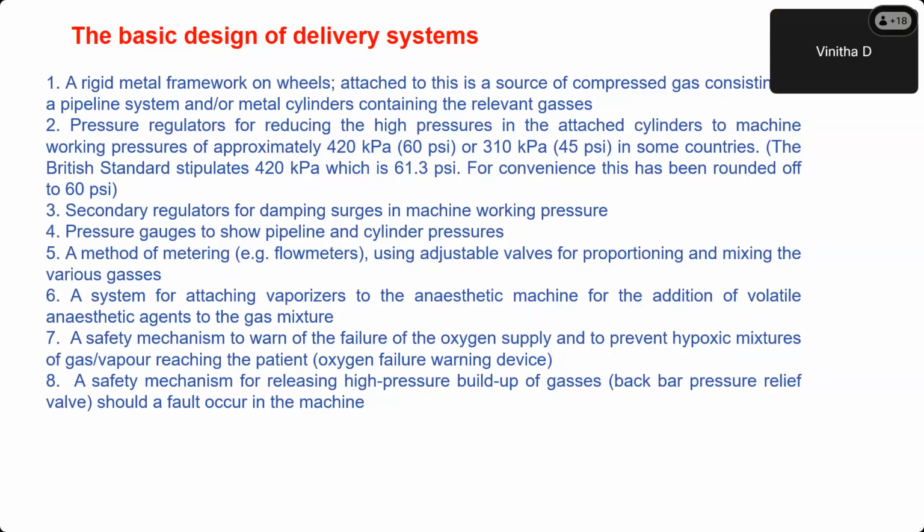You must tell the unit also. For oxygen failure, it said 30 psi, pounds per square inch. But for the pop-off valve to release the high pressure built up inside the circuits, what is the value? It is 30 centimeters of water. Okay, here it is 30 psi, whereas for the pop-off valve it is 30 centimeters of water.